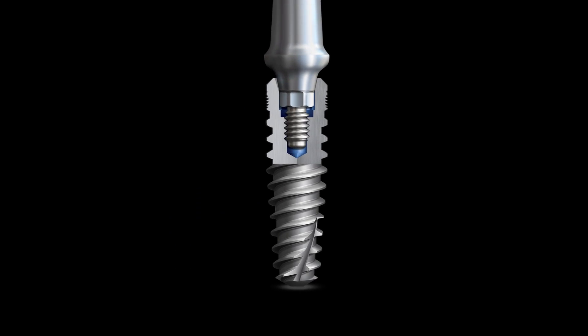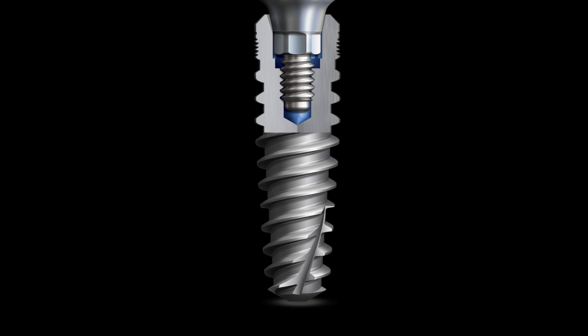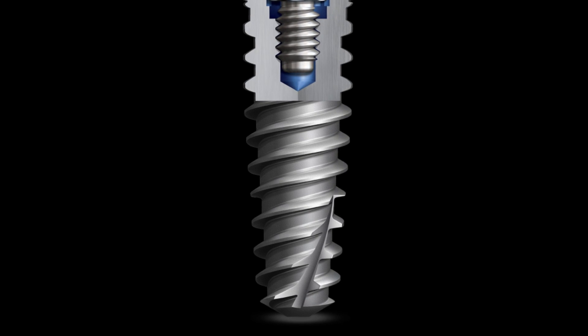With the tapered implant system, you have the ability to place it into more confined spaces, so if you have areas where the teeth are converging, it makes it very, very nice for those situations. The primary stability is excellent. It's probably the best thread design I've ever seen. The primary initial stability of the implant makes it so easy to place implants in immediate extraction sites, or in previously grafted sites, or very poor bone density.